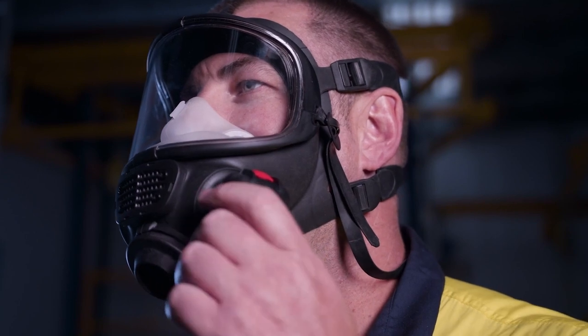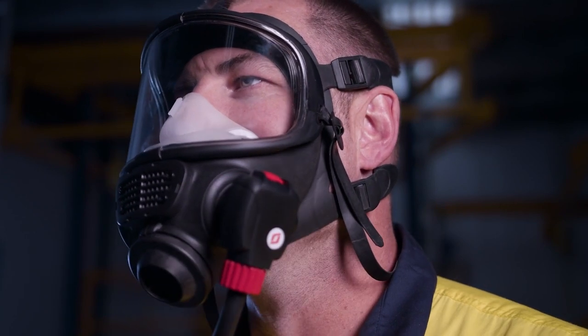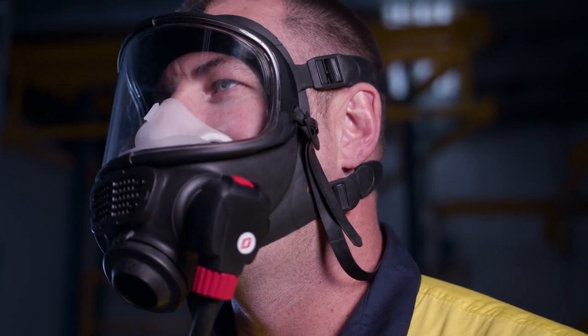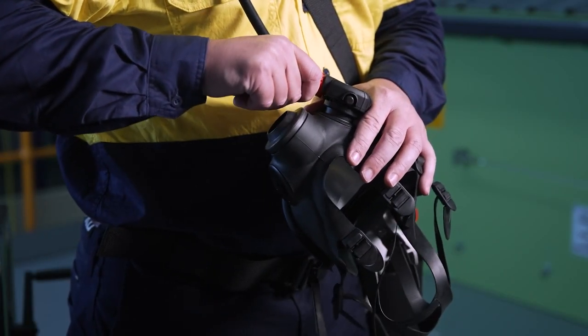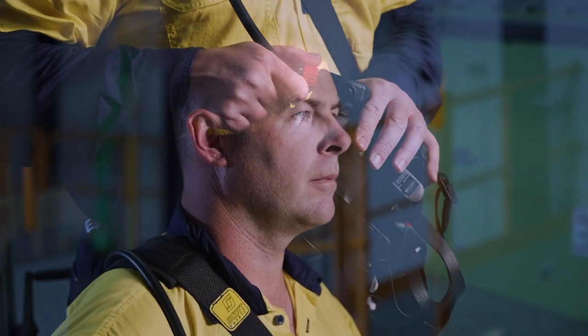The demand valve includes a reset button. Once pressed, airflow is stopped until activated by breathing inside the face mask. There is also a bypass feature for use in the unlikely event the demand valve malfunctions.